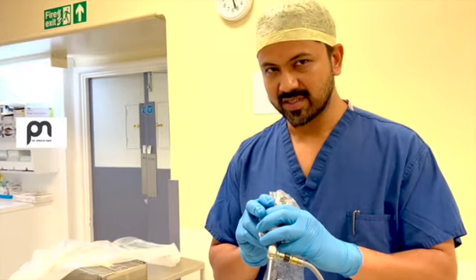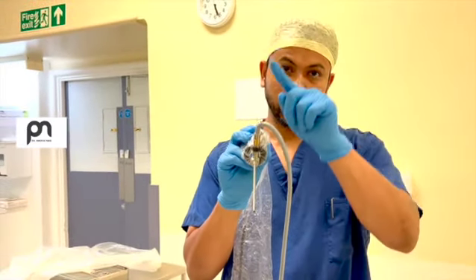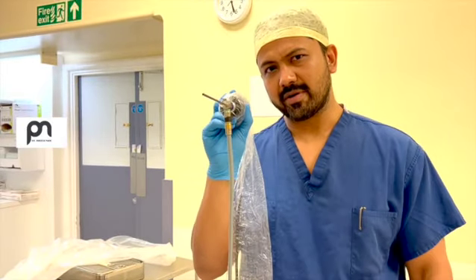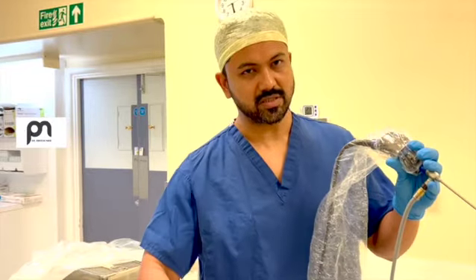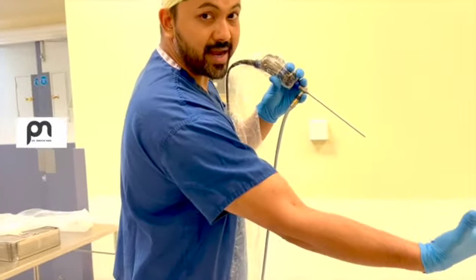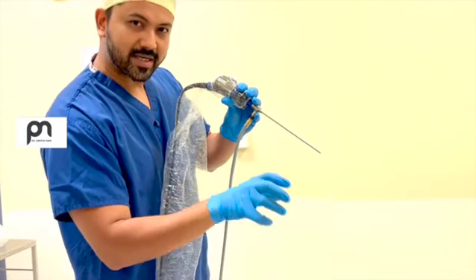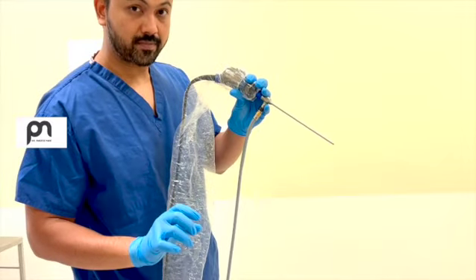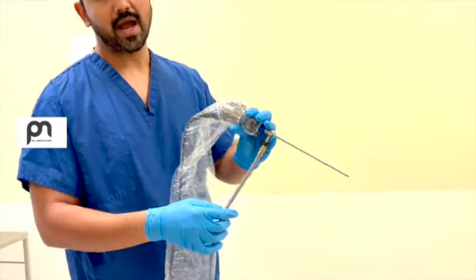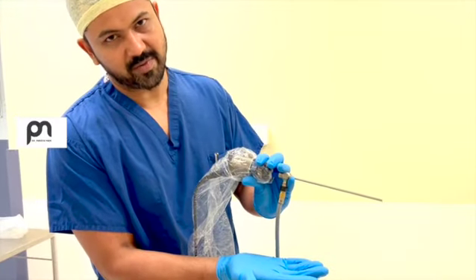The next thing is, as I was saying, this light cable coming up. Which is the position that you want to keep it? Coming from top, coming from side, coming from bottom, coming from the other side. This looks quite sensible, right? Quite sensible. There's no kinking around. But what is the problem? Imagine you're operating, there's a patient over here. This is the head of the patient. And this is the nose and we are going like this. What is underneath the nose? Mouth and an ET tube coming out. The endotracheal tube which is coming out, this thing can hit the tube and unknowingly we can either dislodge it, pull it out, or we will struggle to go properly because there is a hindrance from here.